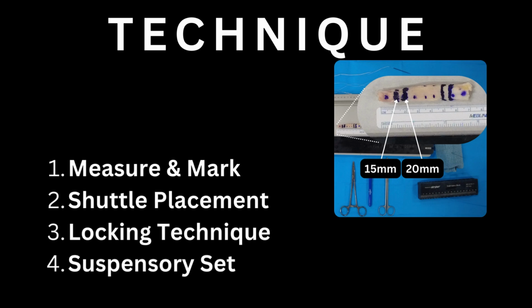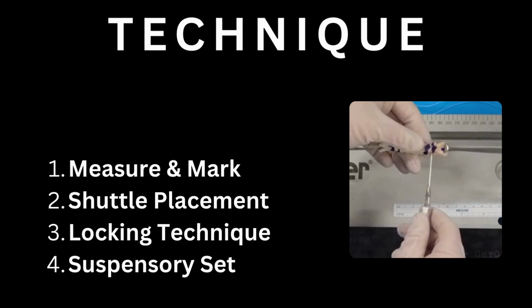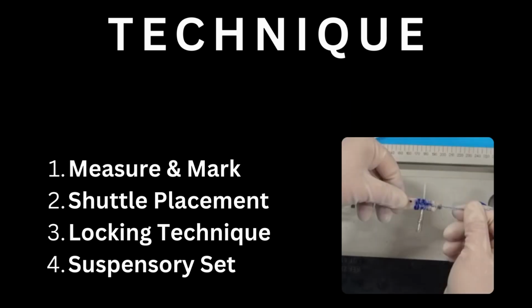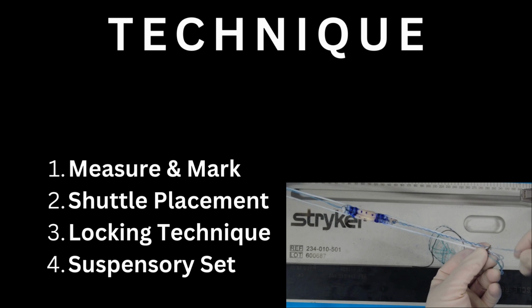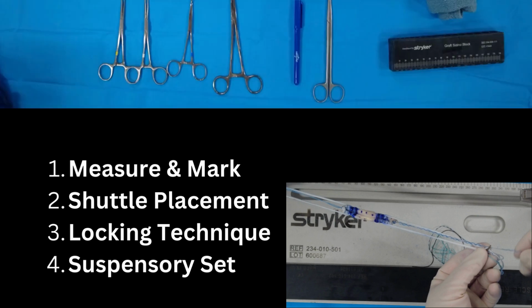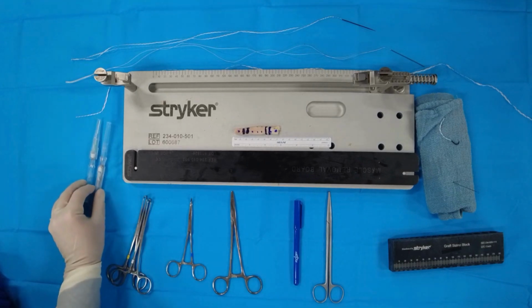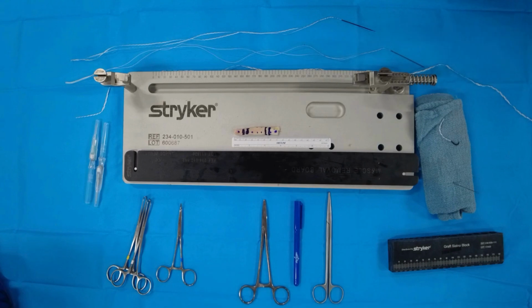And so for this graft prep, we're going to measure and mark. We're going to place an angiocath as our shuttle device, and we're going to do a double locking technique around this and then place our suspensory through this for the final construct. And as you can see, it's a relatively small footprint on the back table. We have our two Alice clamps, two 16-gauge angiocaths, some hemostats, and our graft table.